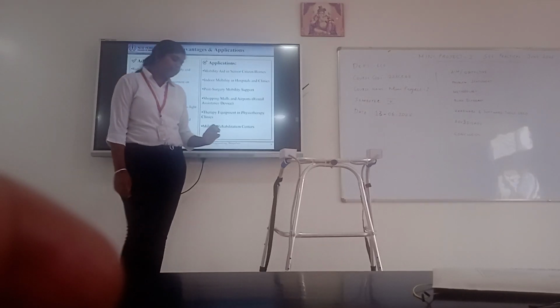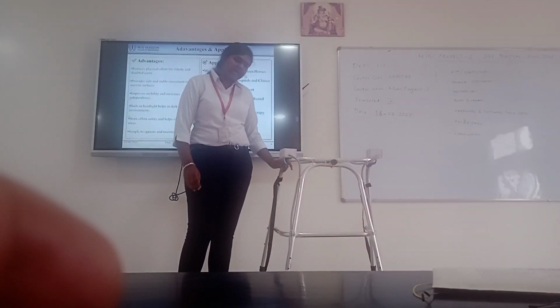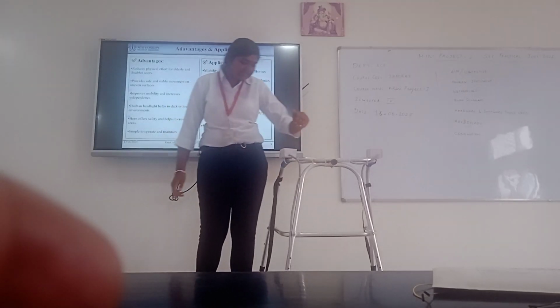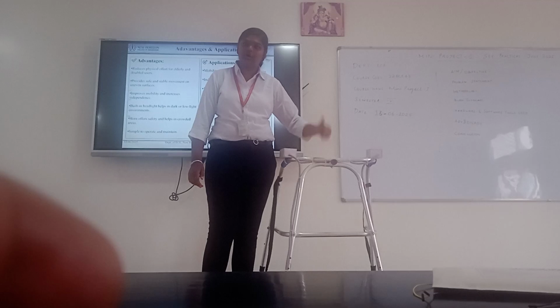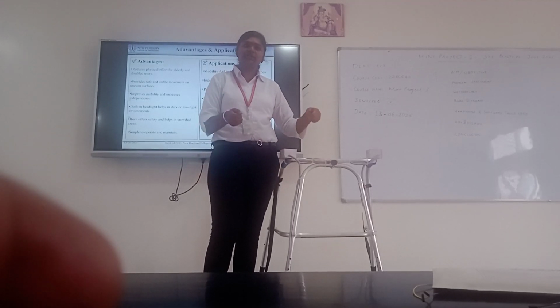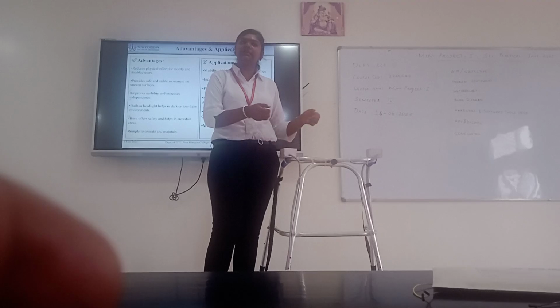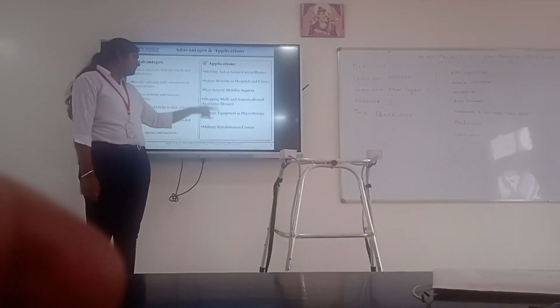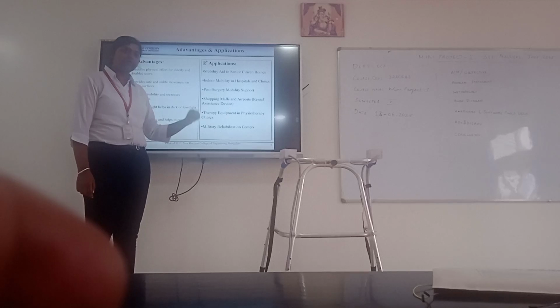Here, this standing stick is made of aluminum, which can break if you apply force. So rather than this, if you connect directly from the base or rod and make a handle, it will be strong and they can move easily. That's why we can use this tool in physiotherapy and clinics.